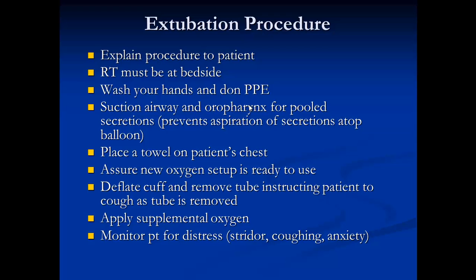Place a towel on the patient's chest because mucus comes out with the extubation. Assure that the new oxygen order and setup is already at the bedside. Deflate the cuff, explain the whole procedure to the patient, and of course apply the oxygen that was ordered.